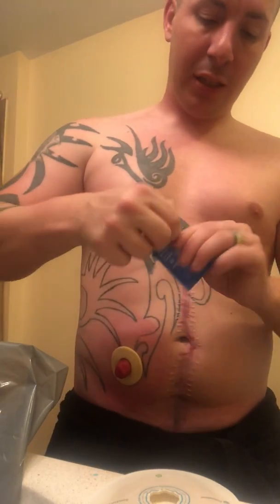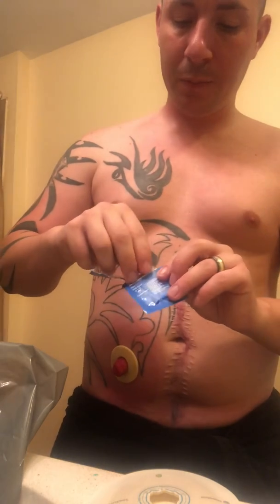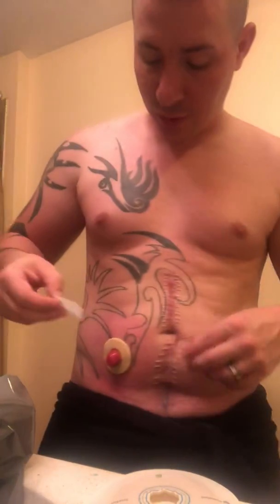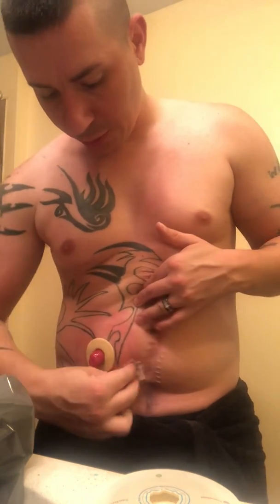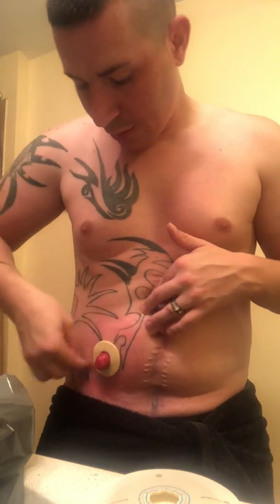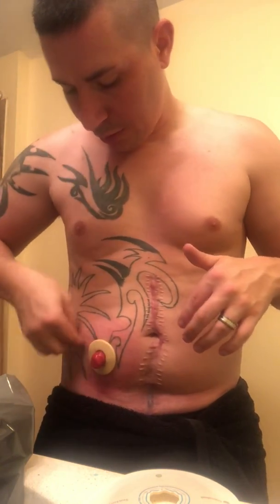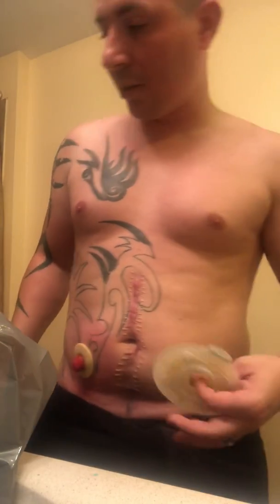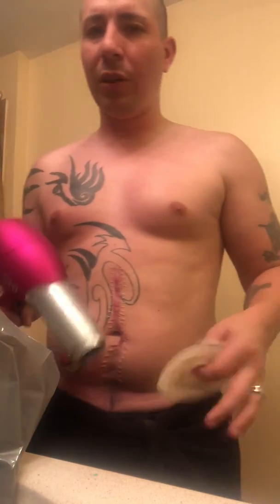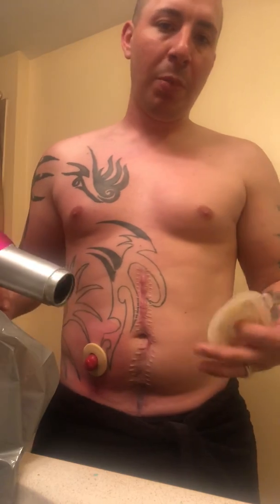All right, now that that's on, we're gonna take our second skin prep wipe and go around the outer edge where our wafer and our Brava strips are gonna sit. Again, make sure you get a good coating along the entire area. That way you get maximum adhesion and it protects your skin so you're not getting the rash underneath. It's not breaking out. It's not degrading the skin. I'm really lucky. I change my bag about once a week, once every 3 to 4 days, depending on how much output I have. And my skin stays relatively good with no issues.